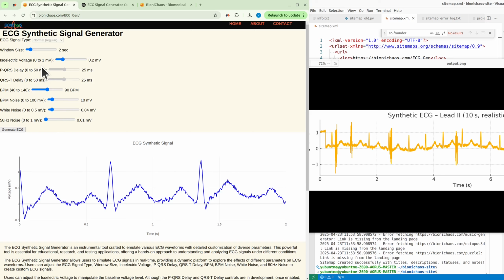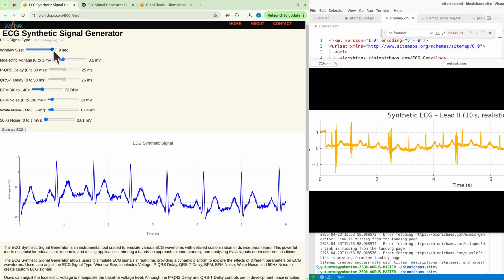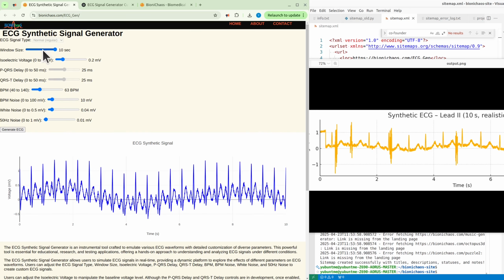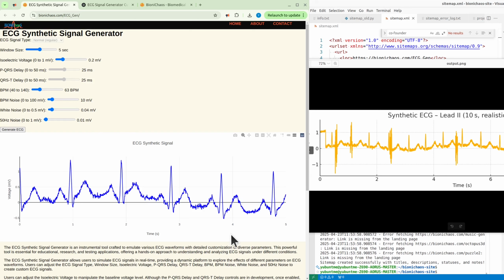It also, for whatever reason, has a backend which we might then get rid of. Okay, we have the BPM, which is working fine. Obviously the BPM is highly dependent on the window size, so don't forget, 10 seconds is the maximum, then you can change the BPM. But you can also trick it by just increasing the window size. So you just have to make sure you're aware what the window size is.